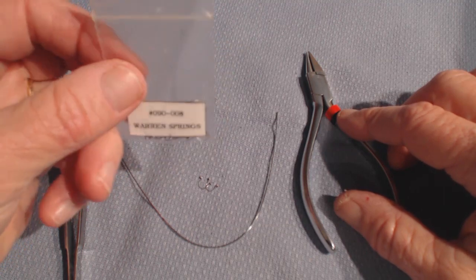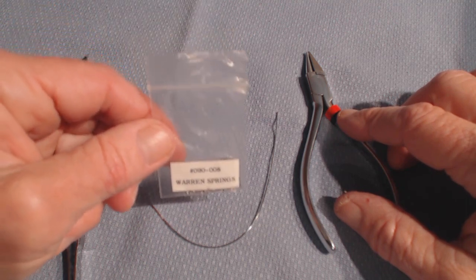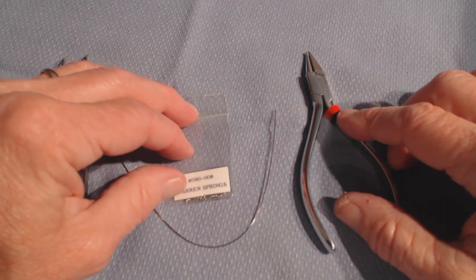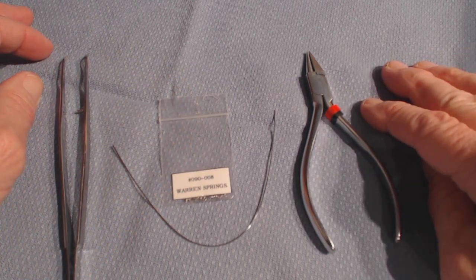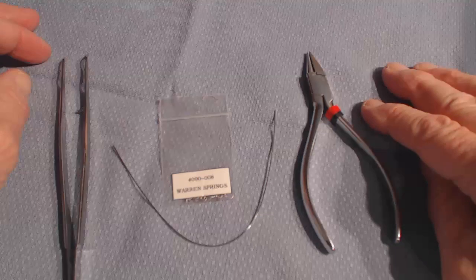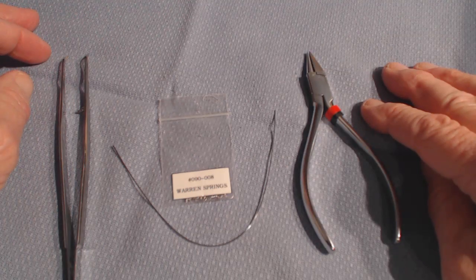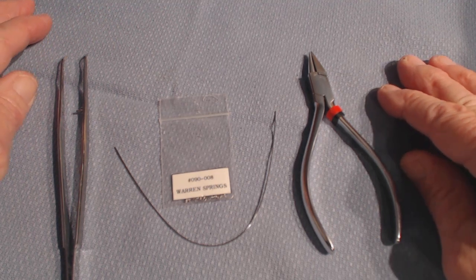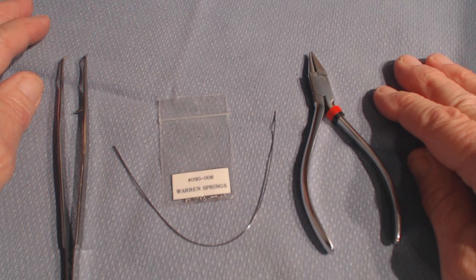And since the advent of the IP bracket, that happened in 2003 with the high torque brackets, the Warren Springs aren't used very often anymore, but occasionally you're going to get a case where there's just one tooth that severely has a torque problem, and a Warren Spring is an excellent solution for that. So it's used very infrequently, but when it's needed, it's really a nice thing to use.